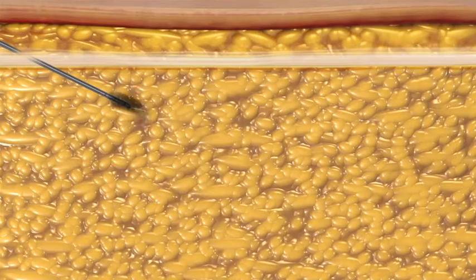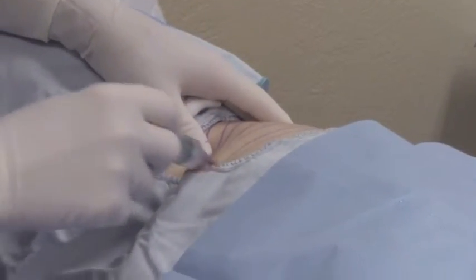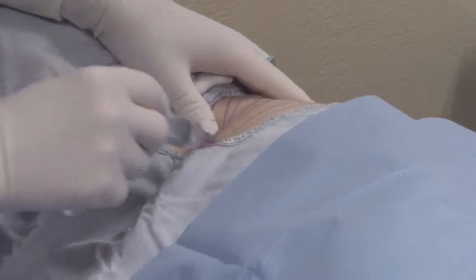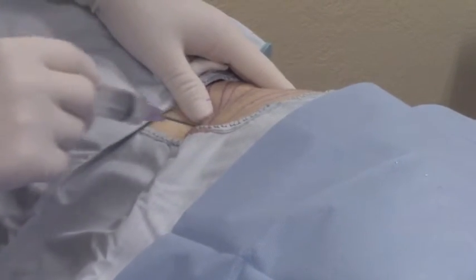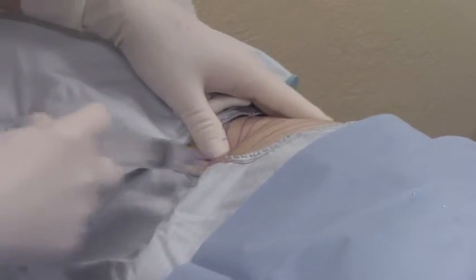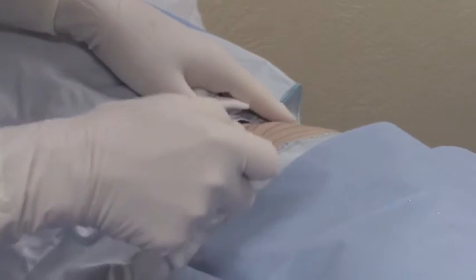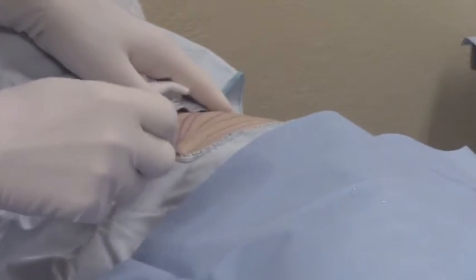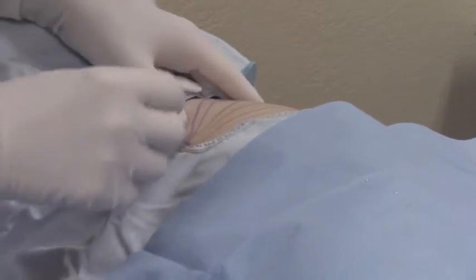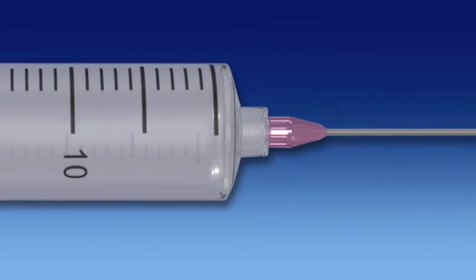Once distribution of the tumescent fluid is complete, a pre-tunneling step should be undertaken prior to harvesting. During pre-tunneling, multiple passes are made with the infiltrator cannula through the donor area in the same spokes-on-the-wheel pattern. This step helps evenly distribute the local anesthetic fluid and more effectively suspends the adipose tissue. After pre-tunneling, the donor site is ready for harvesting.